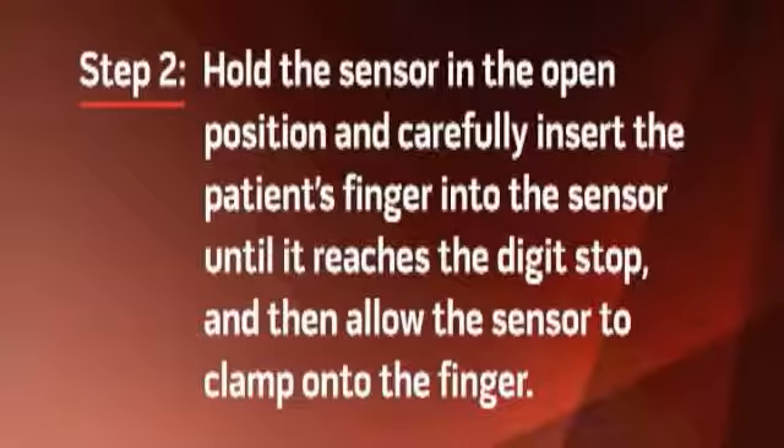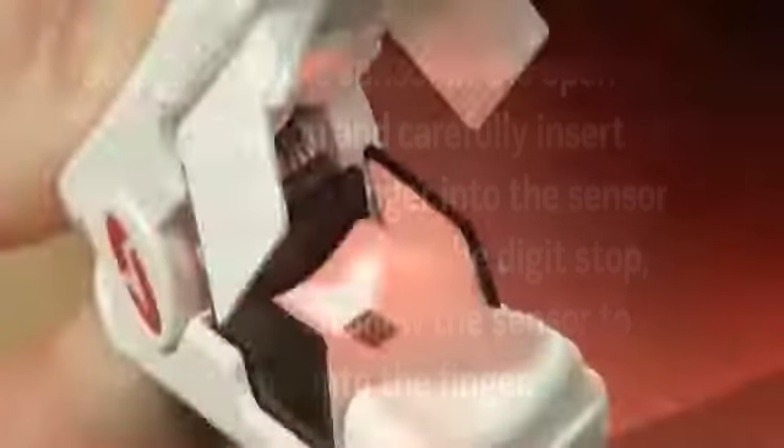Step 2: Hold the sensor in the open position and carefully insert the patient's finger into the sensor until it reaches the digit stop, and then allow the sensor to clamp onto the finger. The digit stop is a small black elevated block located on the bottom of the sensor near the hinge. It is very important that the finger is inserted all the way until it touches the digit stop. Not inserting the finger far enough, or inserting the finger too far, may result in inaccurate readings. The patient's fingernail may extend over the stop tab.